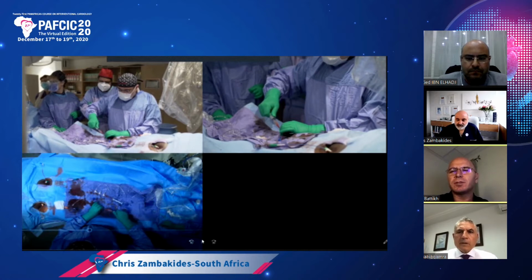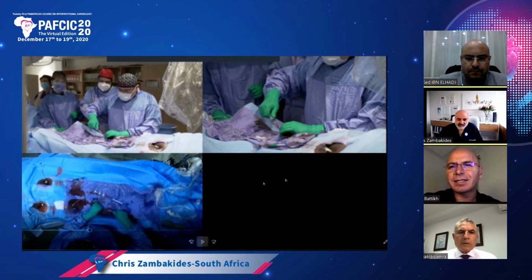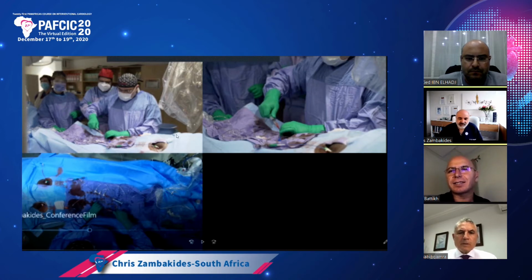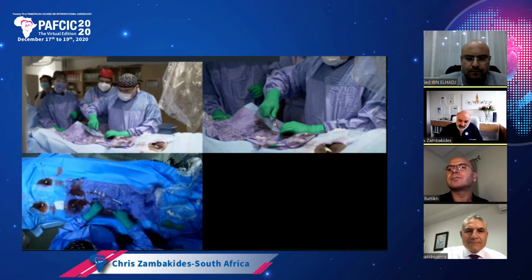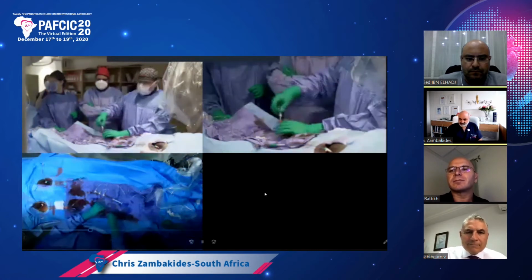Is it possible to do it? Unfortunately, the way that they've spliced it and put it together, I can only show all of them together, but I'll point. So essentially, you need to suck back and make sure that you get blood back. If you inject with force, you're going to rupture the vessel.